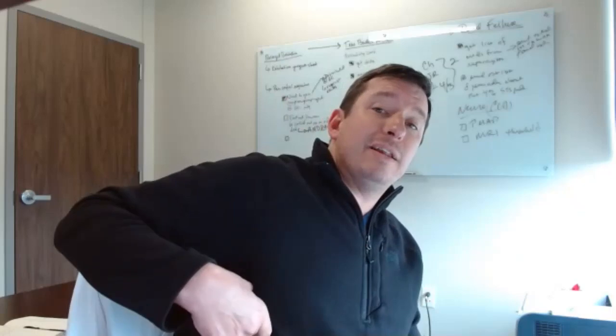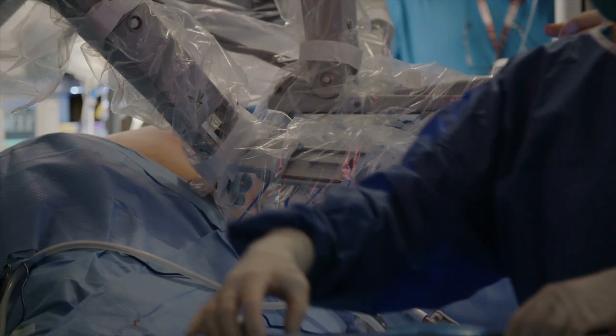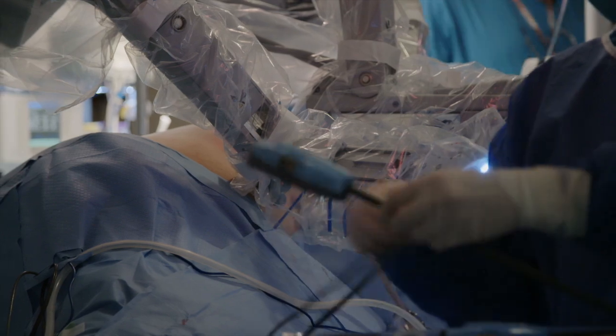And in both cases, really, we have another decision to make, which is what's the right approach to get to the valve? For patients who only have a mitral valve problem or have a mitral valve problem and another valve problem like a tricuspid valve problem, which can oftentimes be associated with mitral valve disease, we usually can use minimally invasive techniques to get there. And minimally invasive techniques can sometimes mean a small incision in the side of the chest, or, and more commonly what I do, is robotic surgery, where we make small port incisions in the chest and a small incision down in the groin for the heart-lung machine. And through that, we can do the entire procedure, either a repair or a replacement.